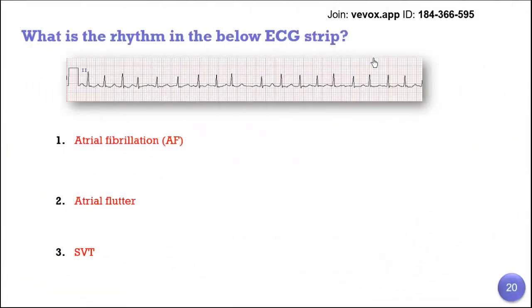So before I start this poll or this quiz, I will give you a clue. I'm a kind guy, as I said. So is this regular or irregular? No P wave? No P wave. Okay. Can you see a sawtooth? No. Okay, so at least we excluded number 2. So we have now to choose between the first and third one.